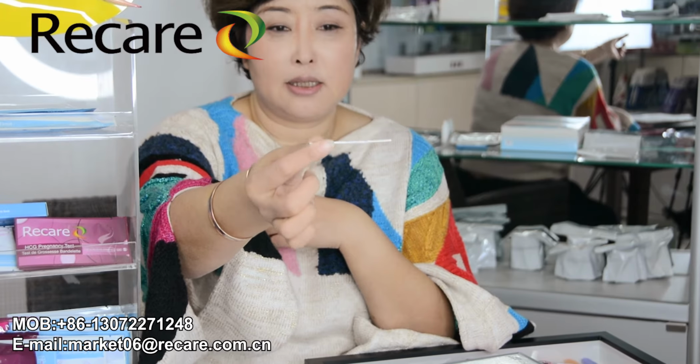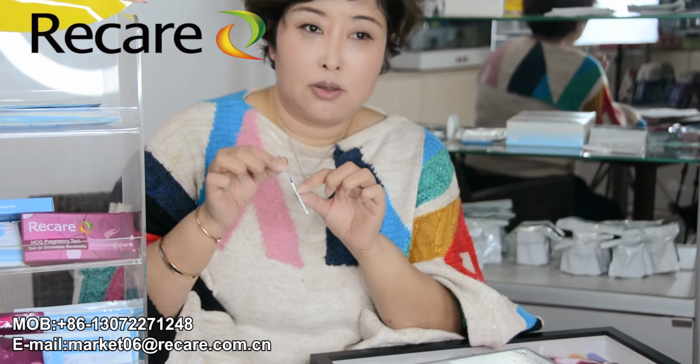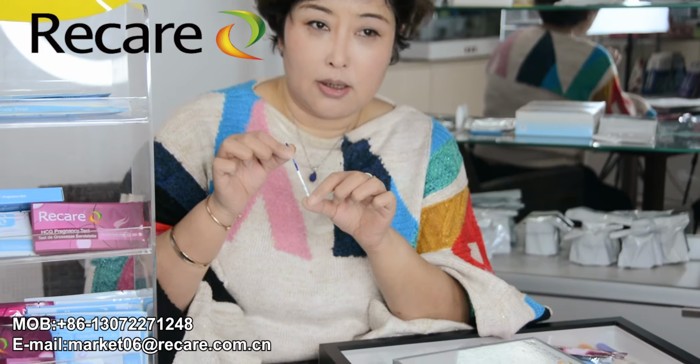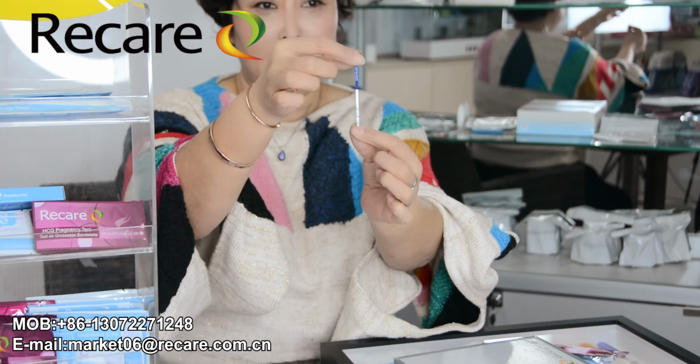Five minutes later, you can read the results. One line, no pregnancy. Two lines, maybe pregnancy. You go to see your doctor. Yes.